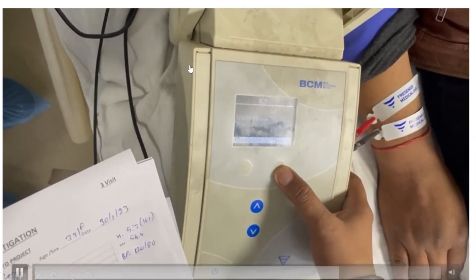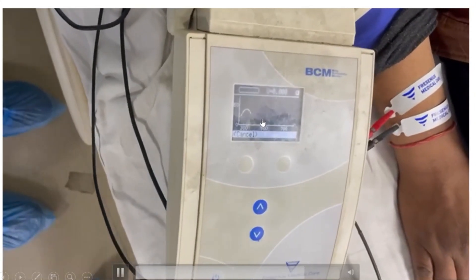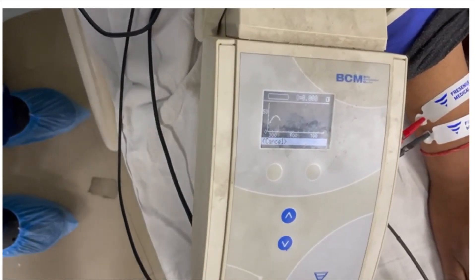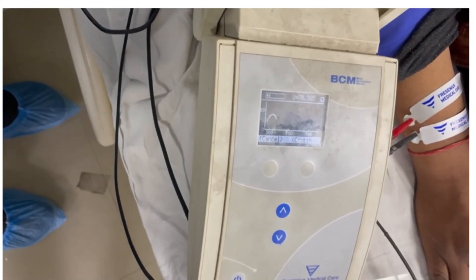Once we press the continue button, the machine starts measuring. A graph is formed progressively, and at the end of this graph the first result is displayed — showing how much the patient is over-hydrated or under-hydrated.